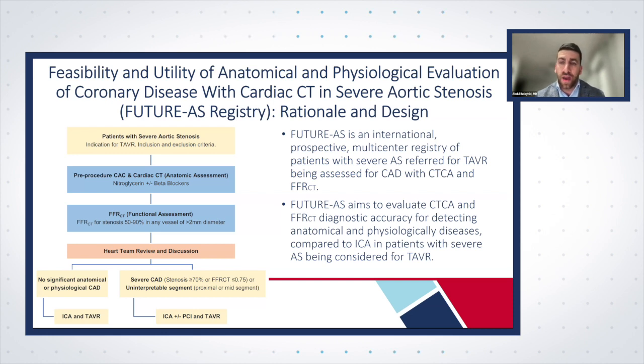It adds to the waiting list time, or as we increasingly say, time to valve, which can be associated with adverse outcomes. And what subsequent data has made quite clear is that no matter how much we keep looking for coronary artery disease with invasive angiography prior to TAVI, we're not revascularizing the majority of these patients. And so it naturally comes about: could we do this differently? There have been some groups that have just used the TAVR CT to look at the coronaries as best they can, just taking the TAVR CT and seeing if they can see the left main and the proximal LAD and leaving it at that.